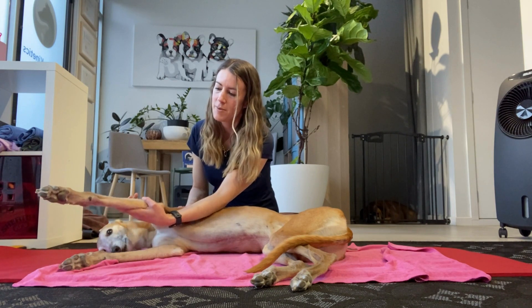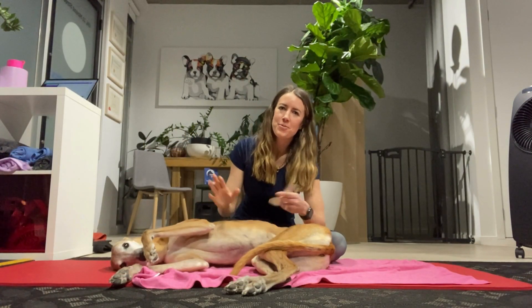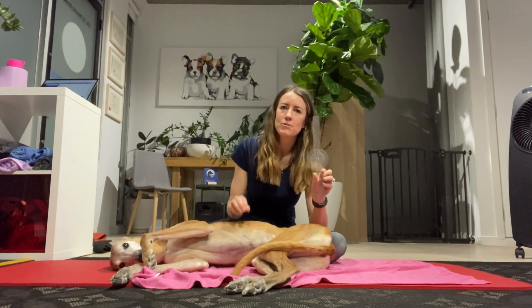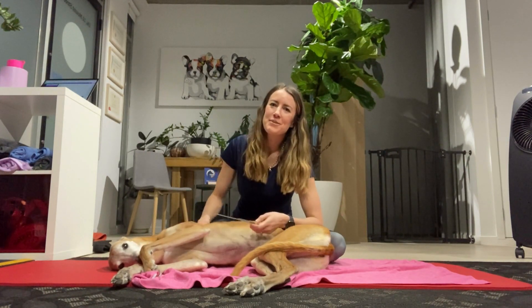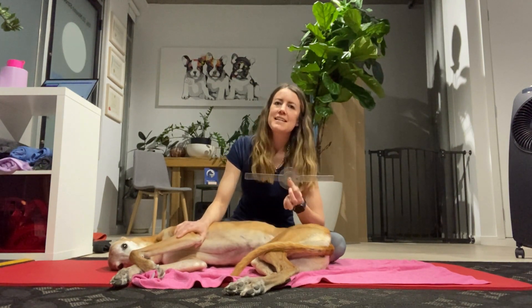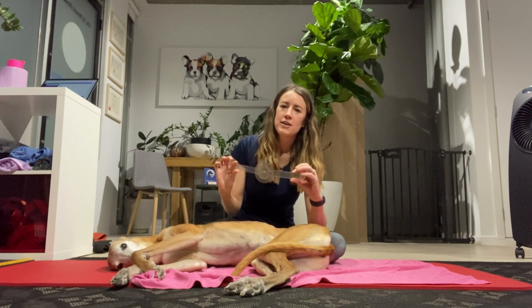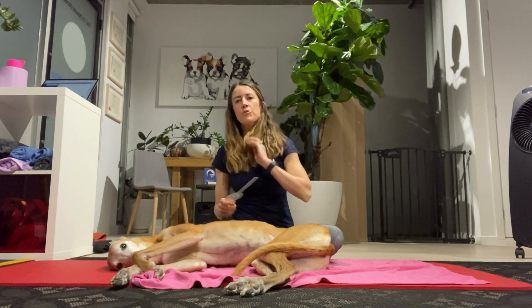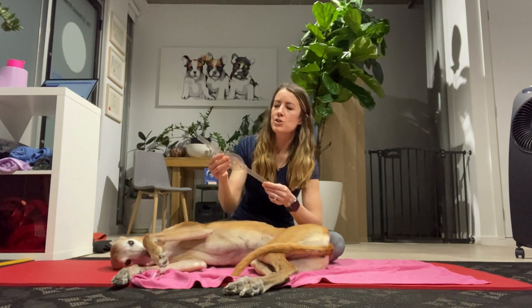Eyeballing measurements have never been my strong point, but if I had to guess I'd probably say she's at about 30 degrees there. If in doubt and you're terrible at eyeballing like I am, grab yourself a goniometer — this old school thing that physios used to carry around all the time. It's a little bit awkward but it can be done; it's easier if you have two people or one of those electronic goniometers that does the angle for you.